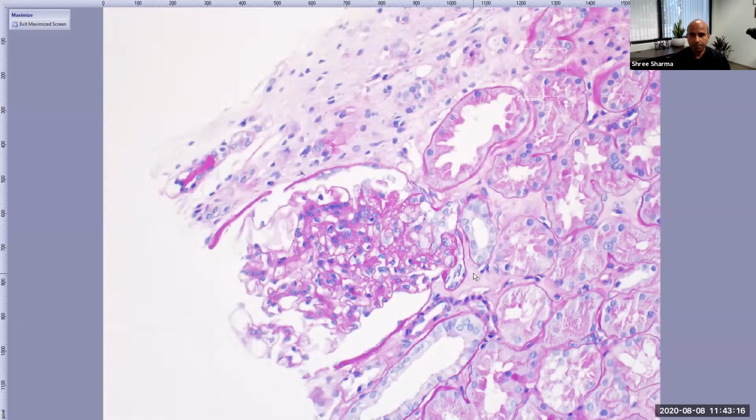And specifically because people approach the same entity from so many angles. But for you as a clinician, you are asking me just one question: shall I give steroids or immunosuppressives, or shall I go for conservative management? That's it. You're asking me. And then we are going to discuss prognostic factors and other things.